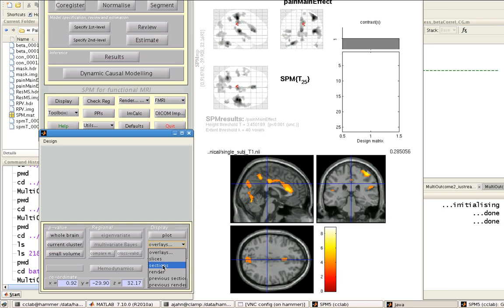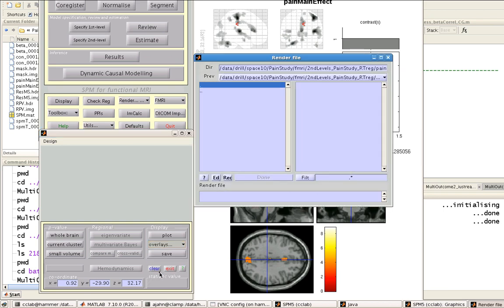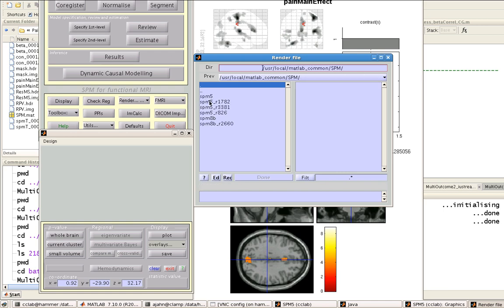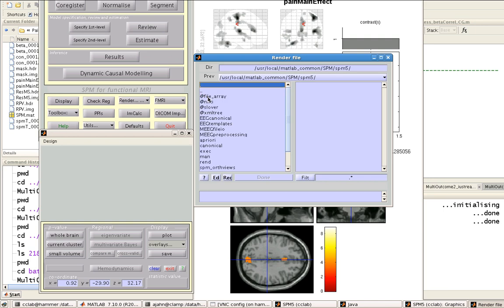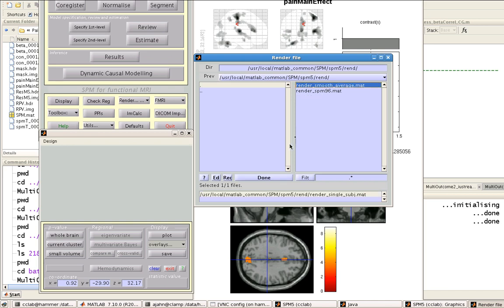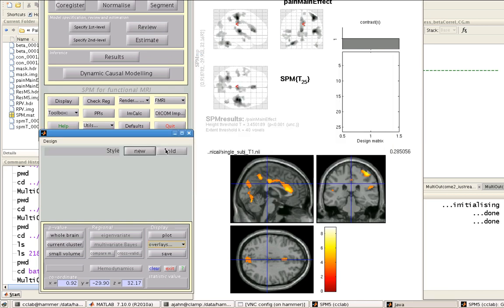Now another way you can do it is by rendering. If I click on overlays and then render, again I go to my directory containing my SPM libraries. This may be different for you. And I click on this folder called Rend. So again, render single subject, you get some more underlying variability in the anatomy, which might be interesting. Click on that, select done.